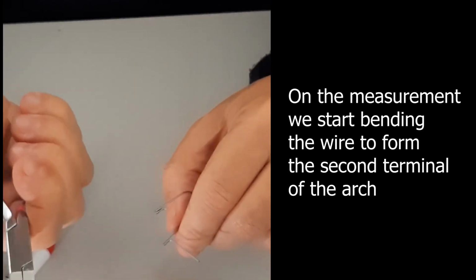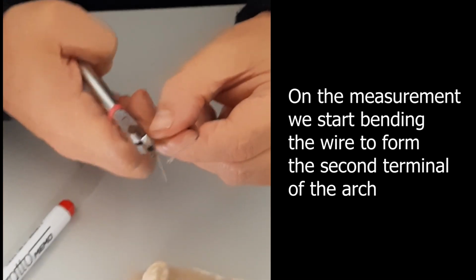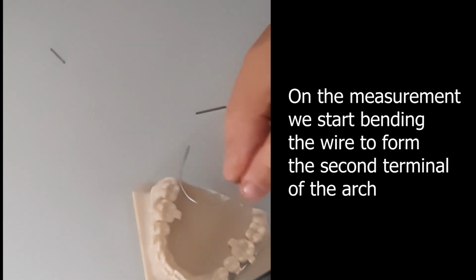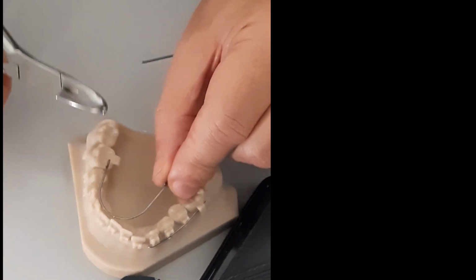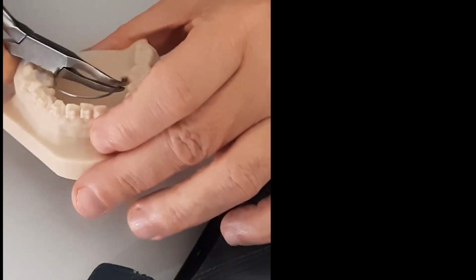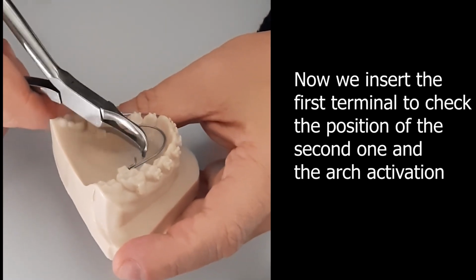Since it's not able to really finish, I'm giving a little bit of compression here without using the groove. But you have to be careful because it can deform everything. And now you will see it's short. This is short because I made it shorter here. Sometimes you make it shorter on both sides and then you can compensate with the angulation on the two sides.